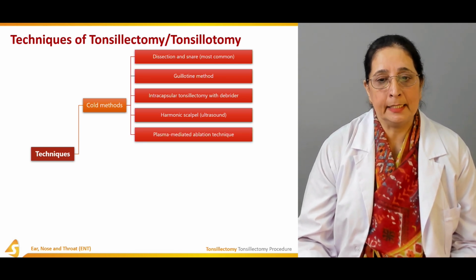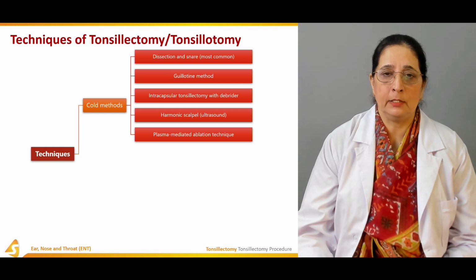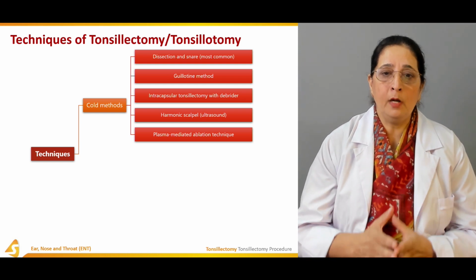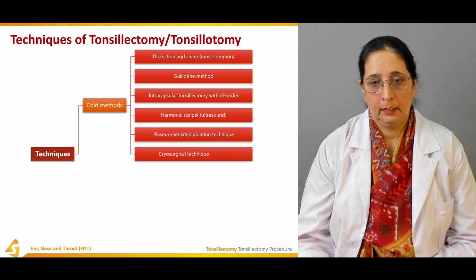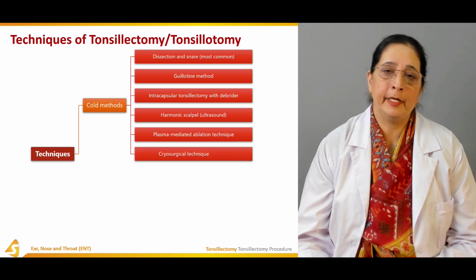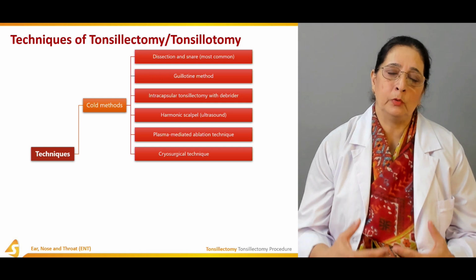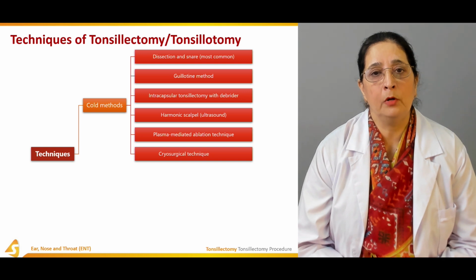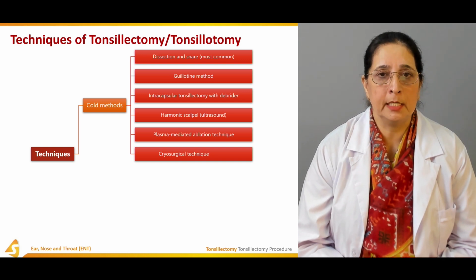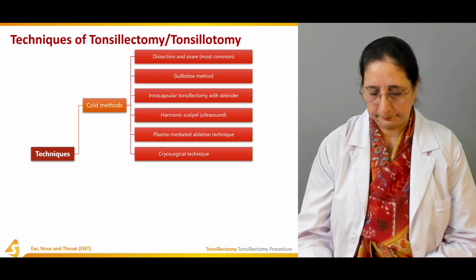Plasma mediated ablation techniques. All these are different cold methods of tonsillectomy. Cryosurgery: cryo means cold, so surgery done by the use of cold or freezing temperature is cryosurgery.